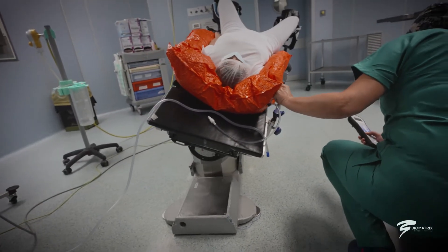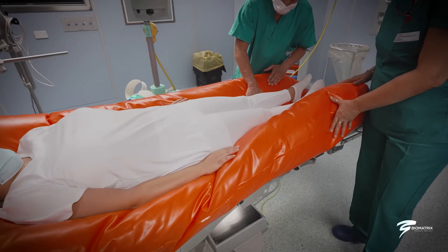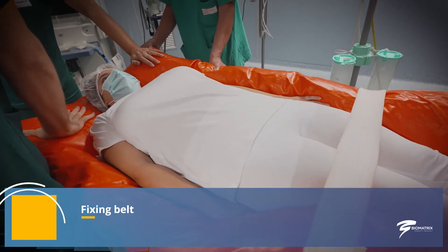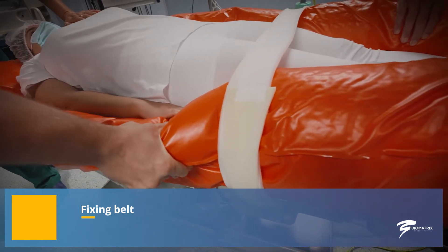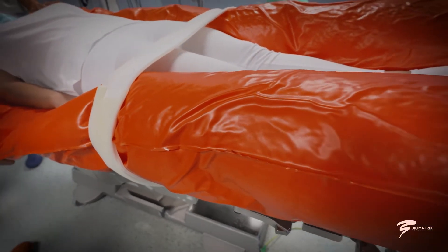The patient can be subjected to radiological examinations thanks to the radiolucency of the mattress. At the end of the intervention, the mattress can be positioned as a transfer sheet and depressed to give it the necessary rigidity, using it as an aid to translate the patient. The vacuum brings numerous advantages to the operator's work, ensuring the highest standards of ease and safety for patients.